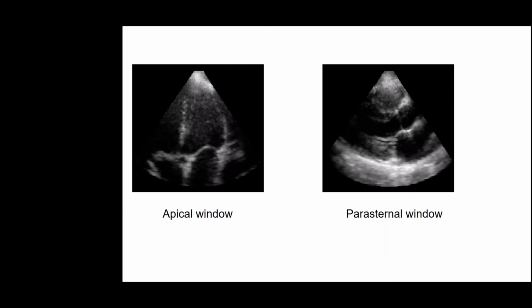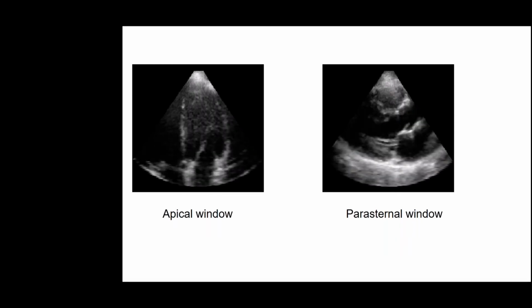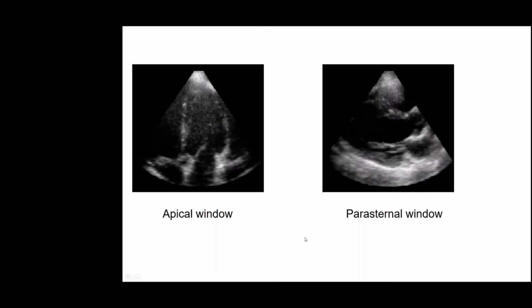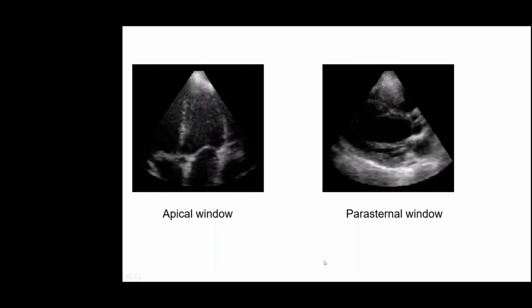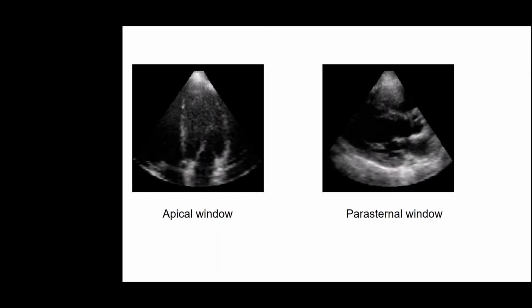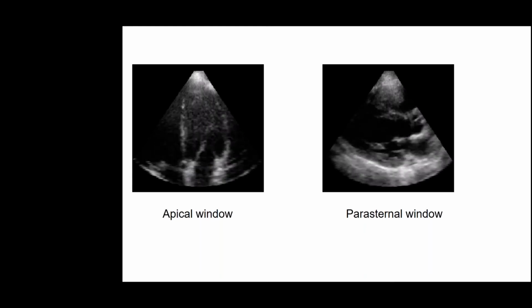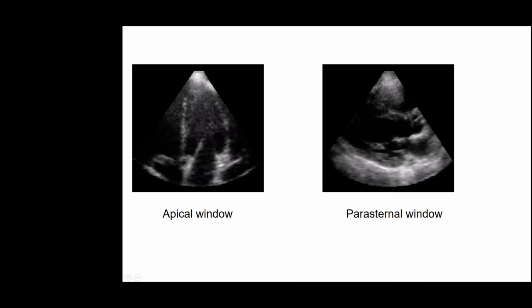These are just 2 examples of images, right? They are not particularly good quality, and I have not chosen them because of that. They are just 2 slices through a 3-dimensional acquisition, so it gives you a quality that is a little bit better than with plain 2-dimensional scans. But I wanted to show you just to get an idea of how the images look, right? So they are always represented in this way.